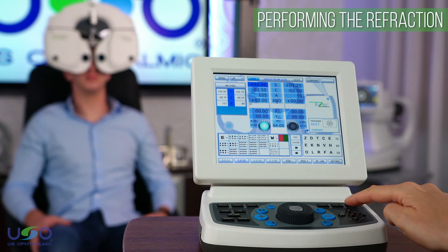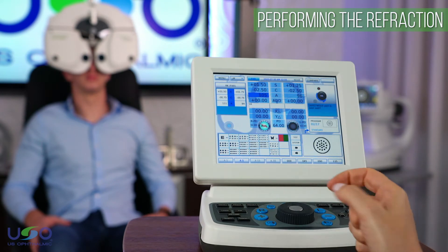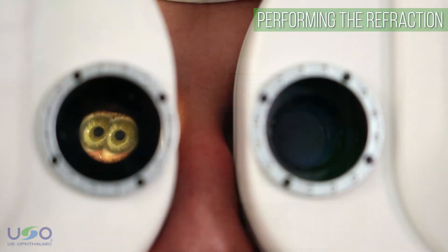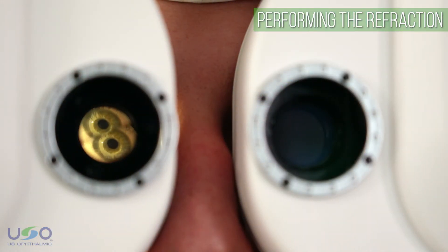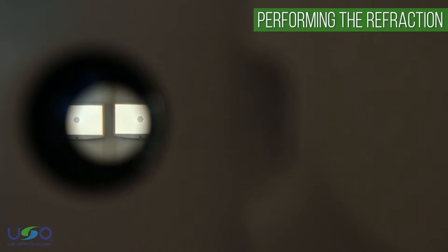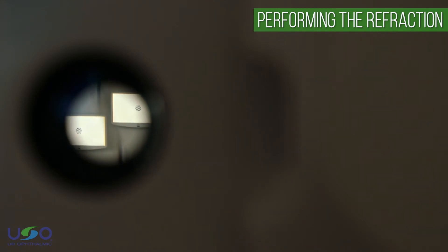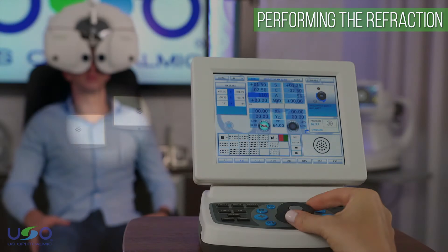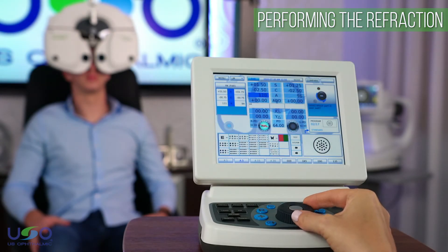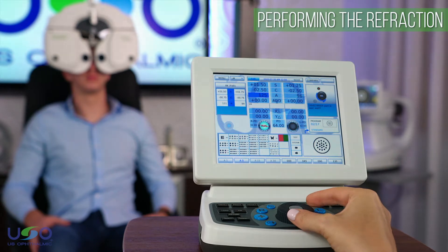An alternative to the Jackson's cross cylinder is the dual cross cylinder, a feature exclusive to the digital refractor. The Easer EDR-9000 provides the patient the ability to view both cylinders simultaneously by combining them in a single lens, allowing the patient to easily compare between the two without having to switch lenses back and forth. This reduces the procedure time and achieves much more accurate results.